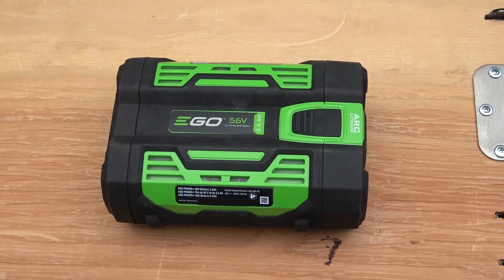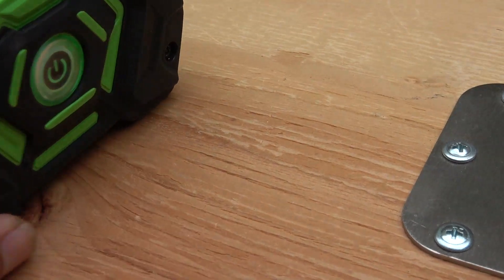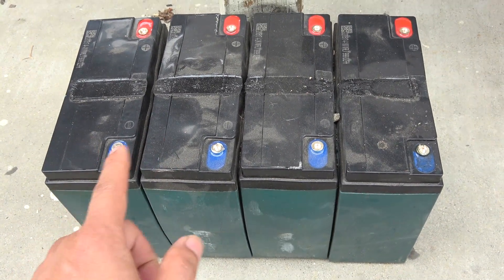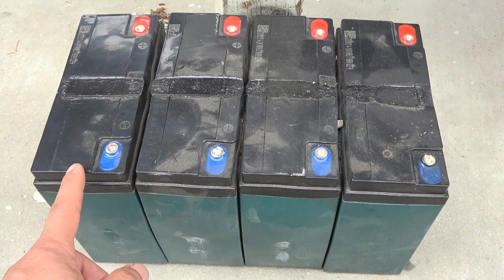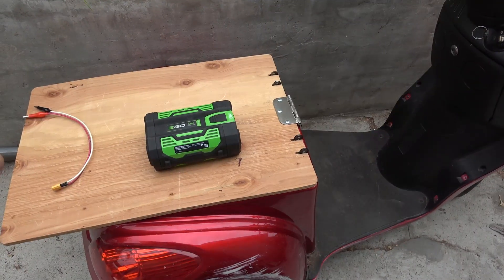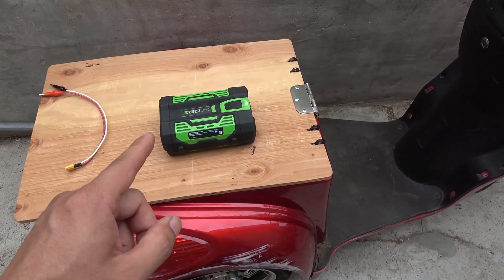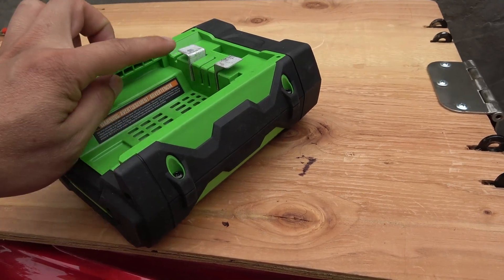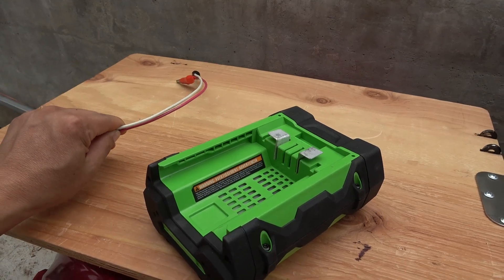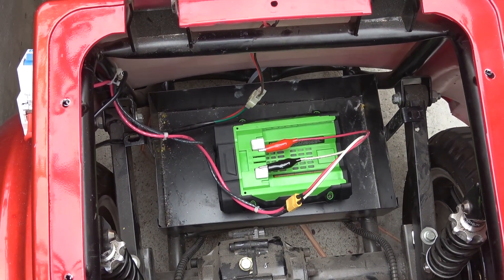I want to see if we can go faster with a better battery, so I have an EGO 56 volt Power+ battery. Right now it's at full charge at exactly 58 volts. For reference, the original lead-acid pack has four 12 volt batteries — at full charge each is about 14.5 volts, so 14.5 times 4 is also exactly 58 volts. I've got to say you shouldn't try this at home — number one it might damage your controller, and number two it's dangerous. I've got aluminum brackets connected to the battery terminals to hook it up to the controller. It's connected — moment of truth. It turns on!